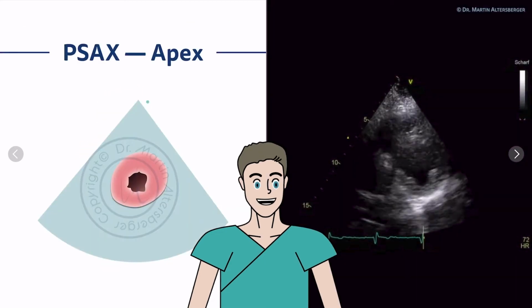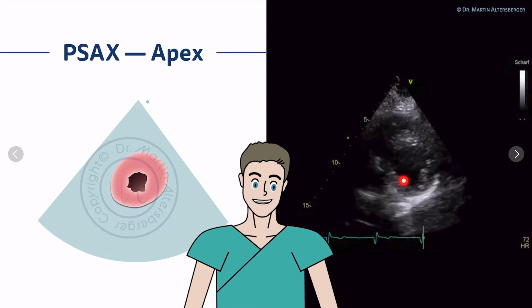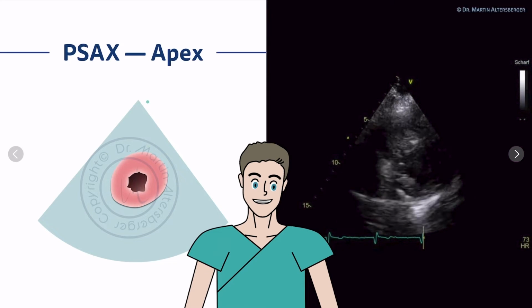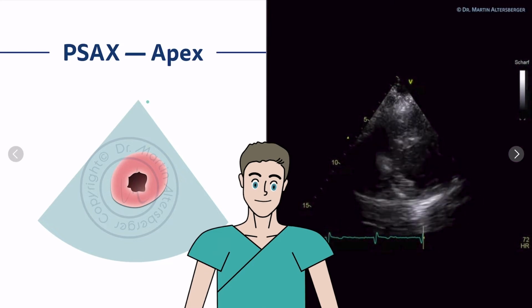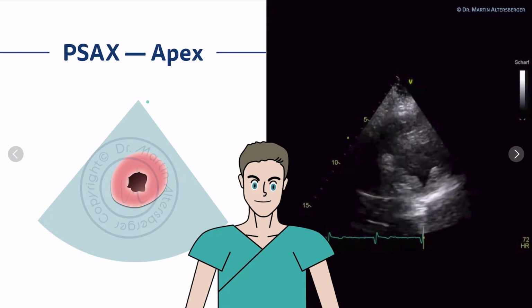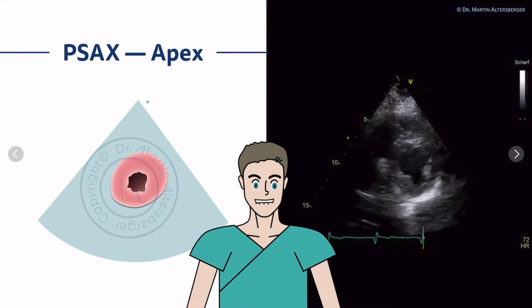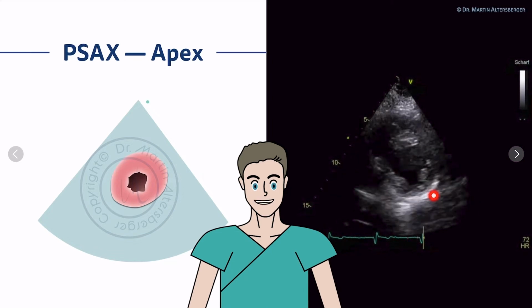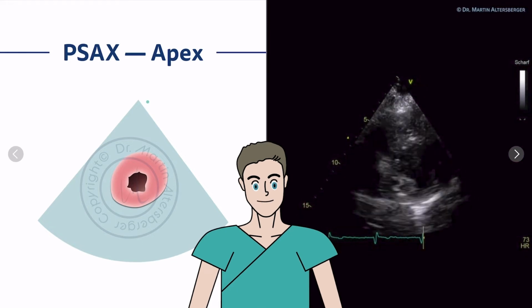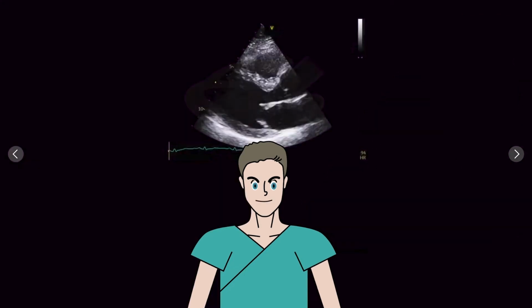How does it look in a B-mode image? Here you can see the round left ventricle. We lose the papillary muscles and we arrive at the apical regions of the left ventricle. All those views are very important to see if left ventricular function is normal, preserved, or reduced, even severely reduced. Also, you can see wall motion abnormalities in case of, for example, coronary artery disease or myocardial infarction. Furthermore, note this bright hyperechoic line, that's the pericardium. In this case, we have normal radial and circumferential left ventricular function and a normal left ventricle.